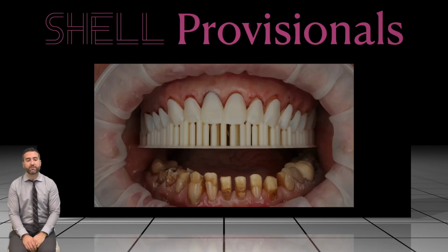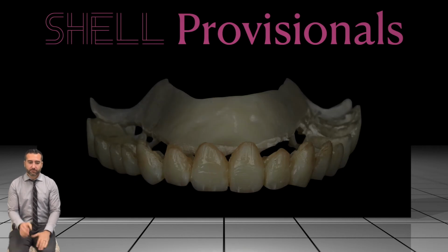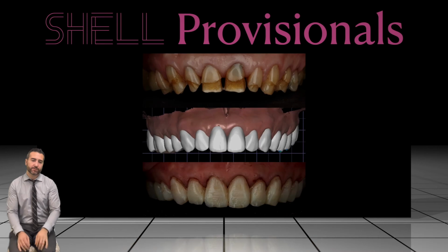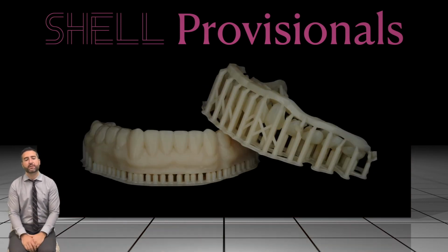These were printed on the SprintRay Pro, and we're using Ivoclar's Empress Direct resins to characterize those shell provisionals. That palatal stop is a vertical dimension stop that gets cut off after you reline these. So you're going to seat that with some bisacryl or acrylic in there, and then you pick it up, take it off and trim that off, and then put some temporary cement in there. Here's another one for the lowers.